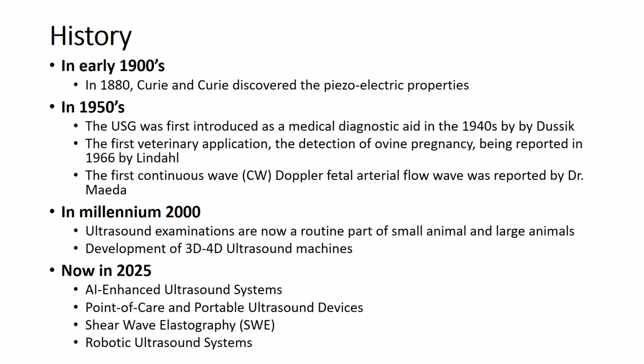Ultrasonic examination in veterinary practice became routine in those years. The development of the 3D and 4D ultrasound machines was going on in those years.